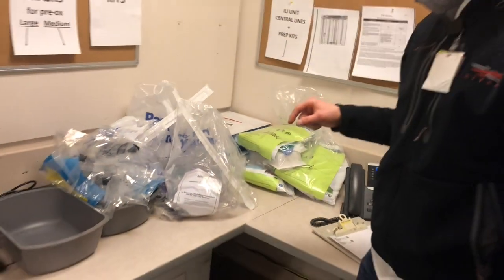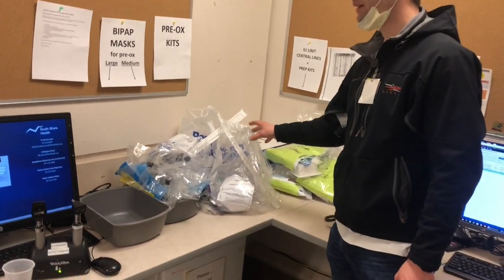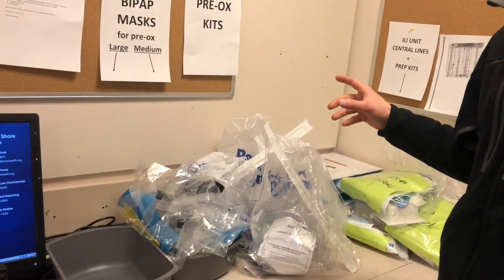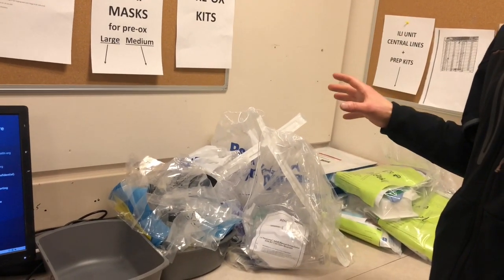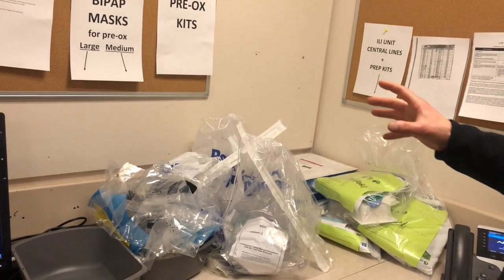The new thing for today and going forward is that we have these pre-oxygenation kits. Specifically, pre-oxygenation is going to be for any patient who needs a non-rebreather level of oxygen. We're trying to do away with non-rebreathers, and we are presuming that those patients very likely will need to be intubated.